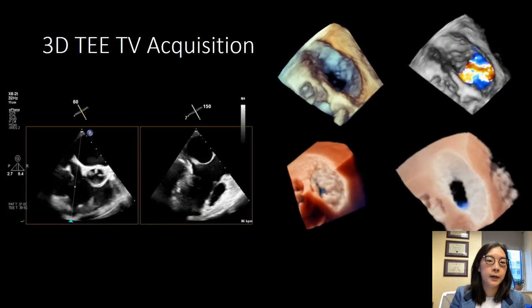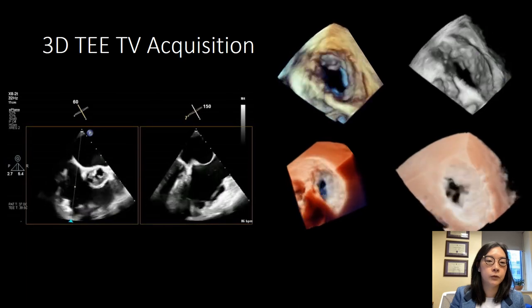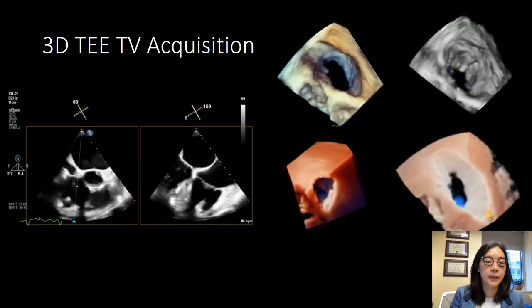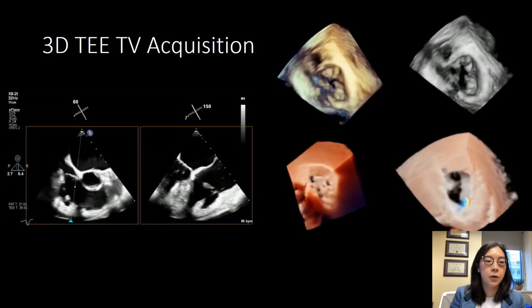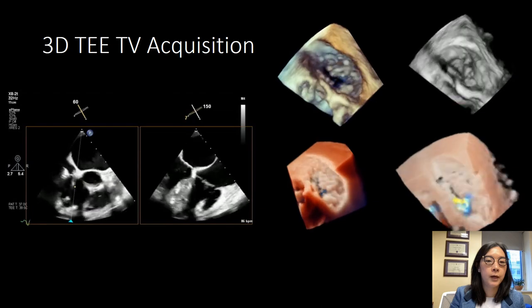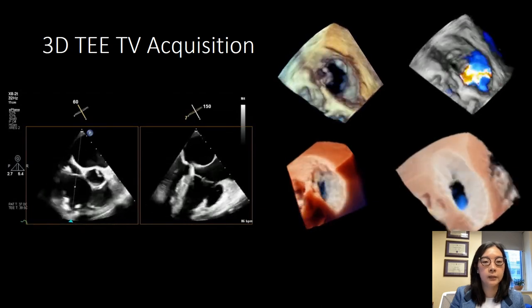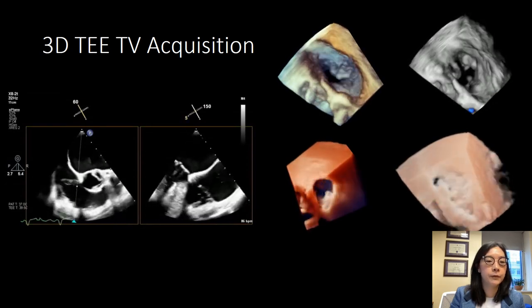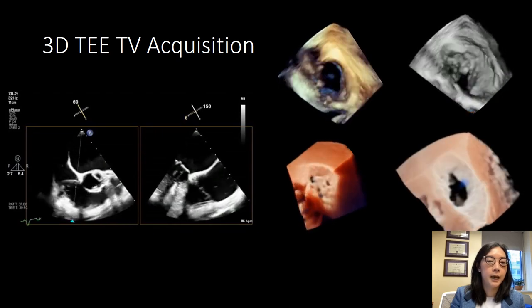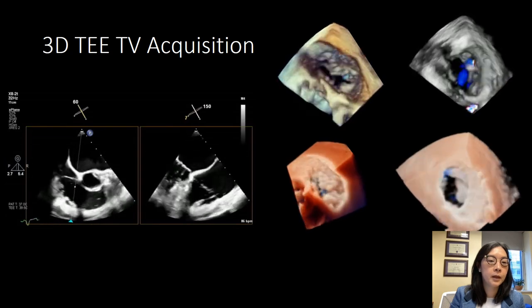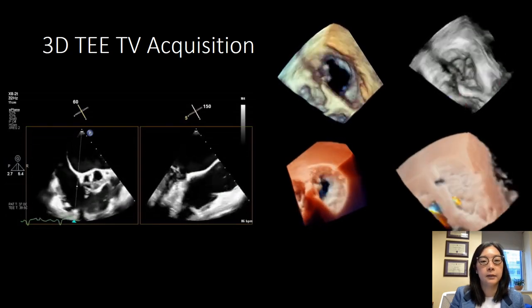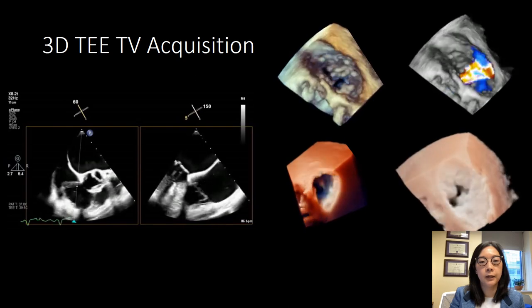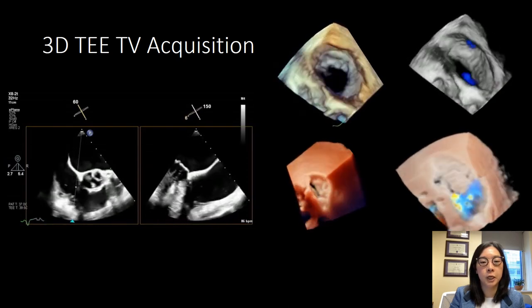In terms of tricuspid valve 3D acquisition, similar to the mitral valve, you want to find an imaging plane where you see the tricuspid valve leaflets very well in both systole and diastole, and you also want to make sure it's as perpendicular as you can get to the beam. When you acquire your tricuspid valve, most of the time because it is slightly off-axis, you will have to use some cropping to display the valve nicely. Here we have a patient with myxomatous tricuspid valve disease acquired in this mid-esophageal inflow-outflow view, then cropped to align it so we're looking en face at the tricuspid valve leaflets, showing both the prolapse and the regurgitant jet coming through.